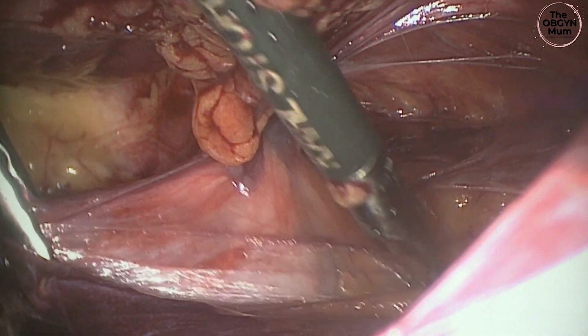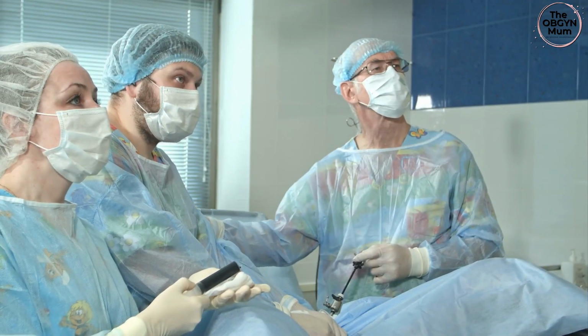The small cut will usually be made on the tummy, in or near your belly button, and then the laparoscope is inserted through this cut, and then the abdominal cavity is filled with gas, carbon dioxide. Sometimes if you've had other operations before, we're extra worried about the scar tissue, we may start with the first port being placed in a different place up by your ribs. The surgeon will usually make that decision on the day.